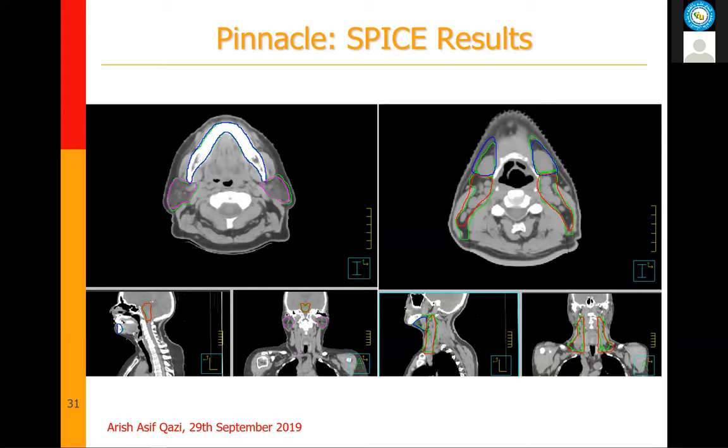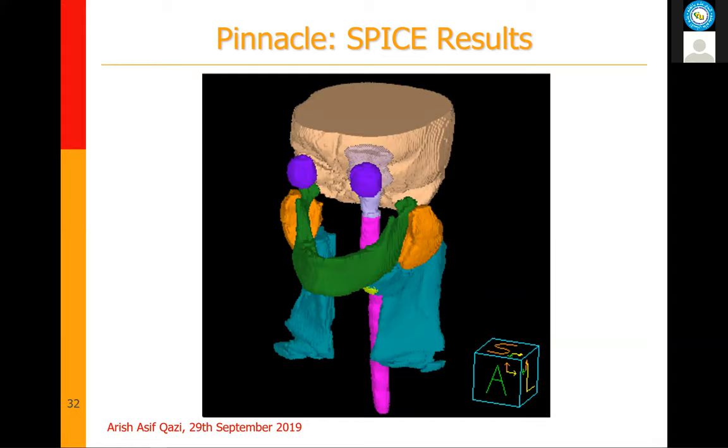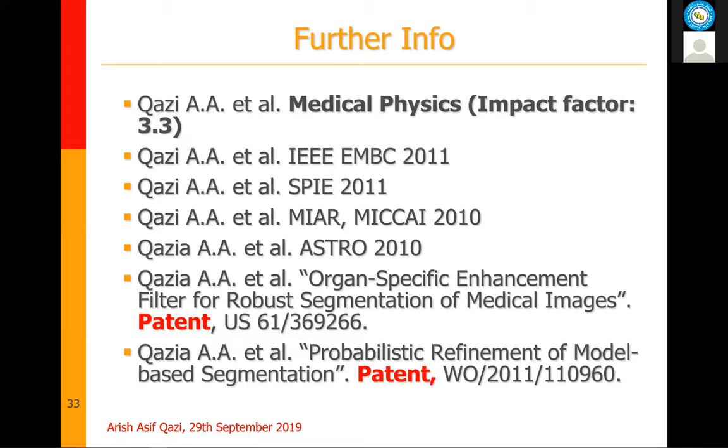It has now been in routine use, and the feedback that I've got is really good. Imagine that now you don't have to spend 3 hours. In a matter of minutes, your contours are generated. This is another example of the methodology, and here you can see that all these organs were segmented within a matter of minutes. So for some more information, if anyone is interested.